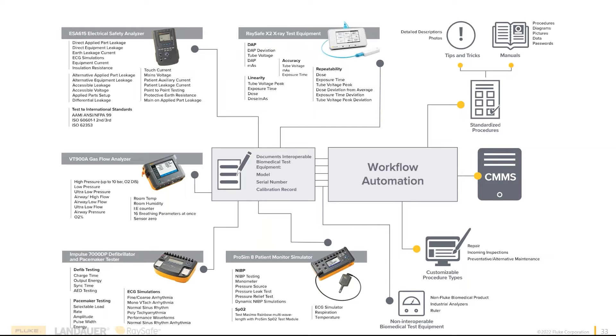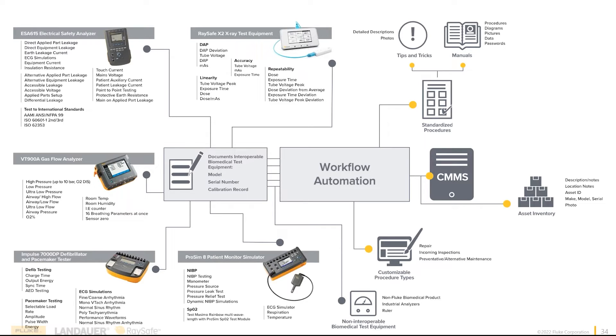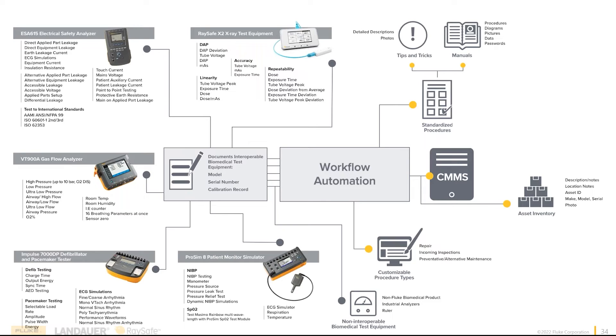But there's more to workflow automation than just procedures. We also have an optional asset inventory. You can collect the make, model, serial number, very similar to what the CMMS system is doing. But in here, you can do things like embed pictures. You're looking for the x-ray machine that looks like a giraffe, not the one that looks like a firetruck. You can take a picture of that and insert it. Or maybe you could take a picture of the ZOLL R series defibrillator so the new guy goes out and he's grabbing that one, not the ZOLL X series. You can also add notes, like the code for the door is 1-2-3-4. Go in, third ceiling tile to the left of the IV pumps. Because I don't know why people hide things in the ceiling, but as a biomed, we all know that happens. All those notes can be collected by that specific make, model, serial. You can even record the software versions, the special tools you're going to need, or make sure you let the OR staff know before you show up so they can have it freed up.